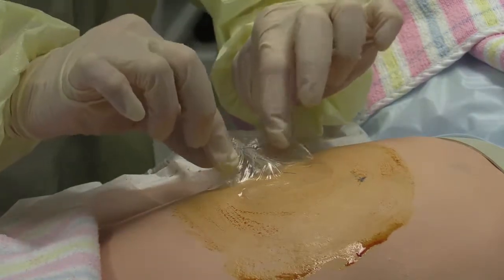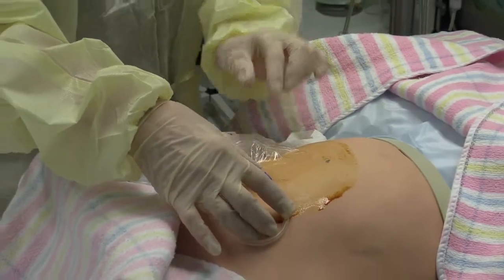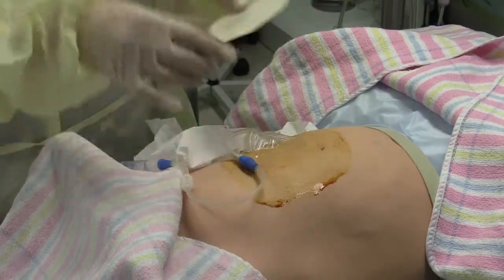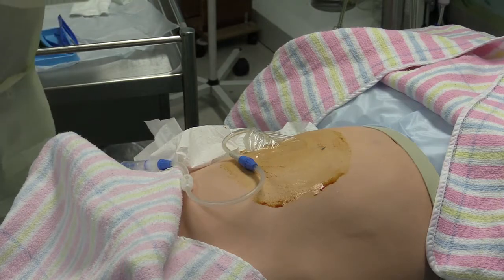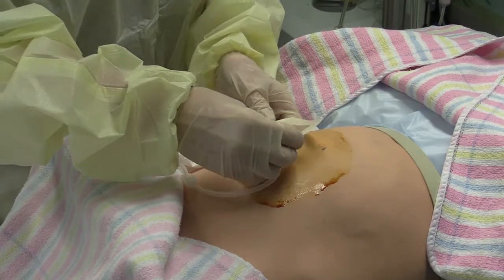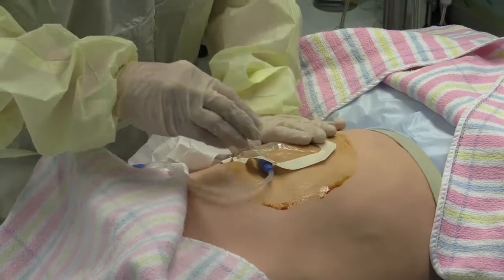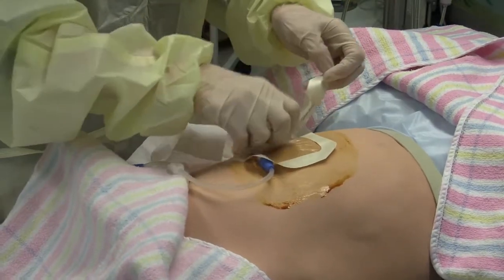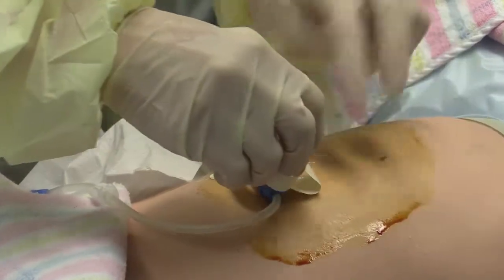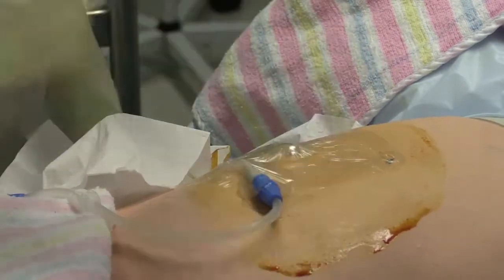So that catheter is sealed now, and to secure it, I'm going to curl the catheter around and place the large dressing over the top. And that protects the exit site from traction and damage, as well as sealing the dressing, so that if you pull on the catheter it doesn't pull at the exit site.